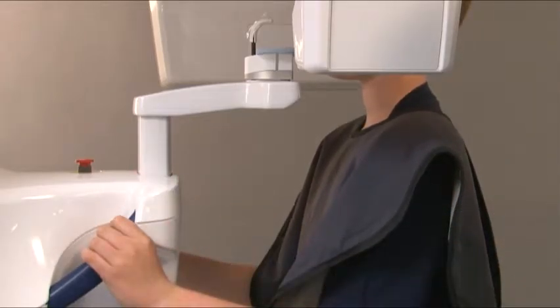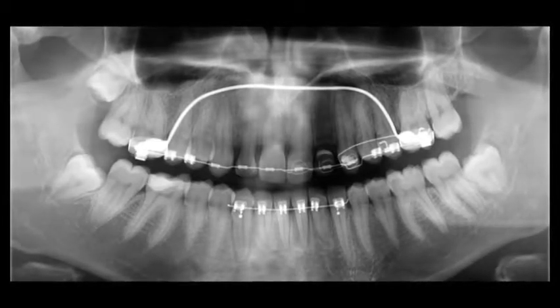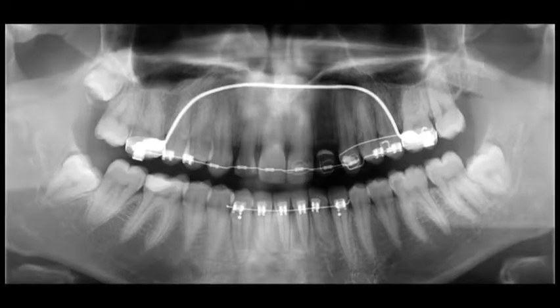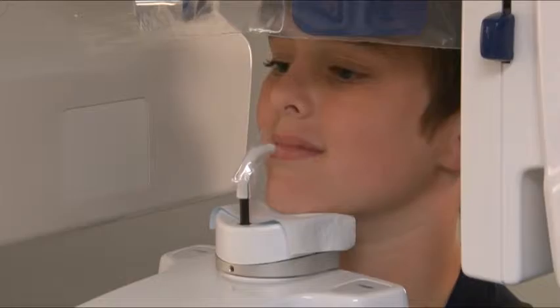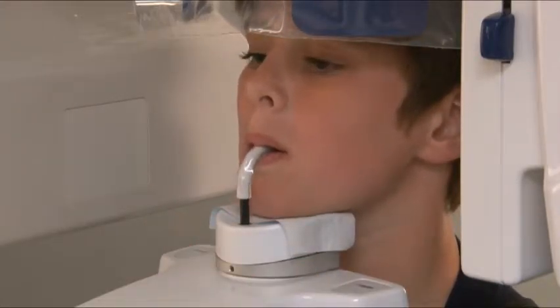Ask the patient to step into the unit and grab hold of the handles. Excellent image quality is a result of careful attention to positioning — good positioning equals good images. Ask the patient to rest his or her chin on the chin rest. For dentate patients, they should place upper and lower anterior teeth into the groove on the bite guide.